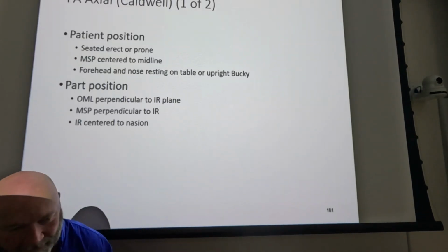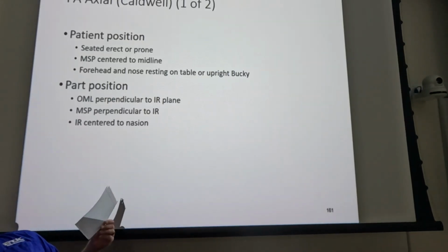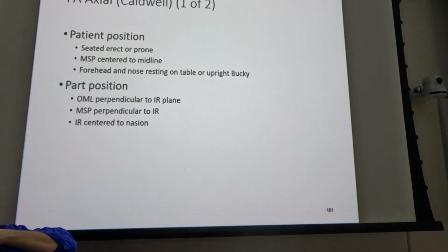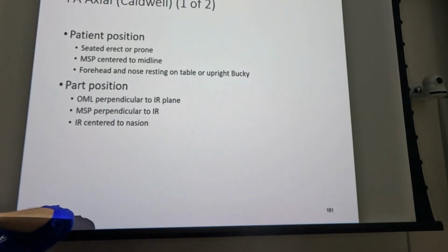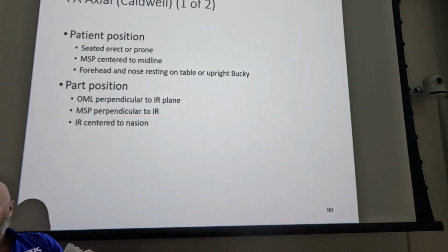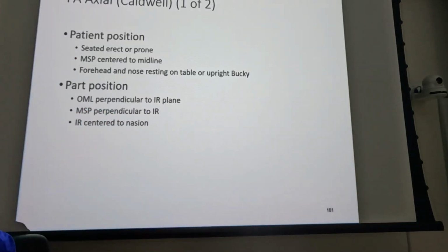All right, so you get the patient lying flat on their back. You take a piece of paper and get their chin extended and head tilted, and you put it on those three things: chin, cheek, and nose. And when it's parallel to the floor, then you've accomplished that, okay? And then you just center to the open orbit. Does that kind of make sense? It's a whole lot easier than trying to figure out that whole 53-37 thing.